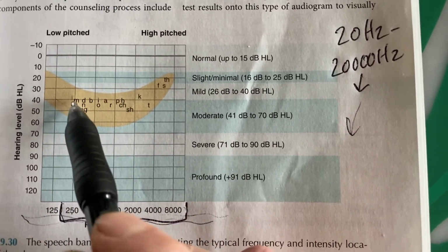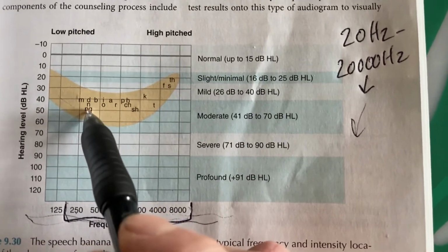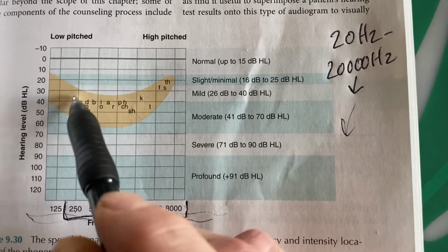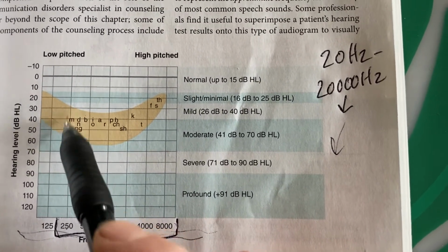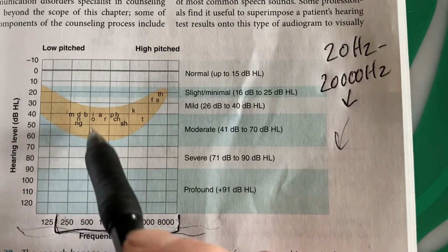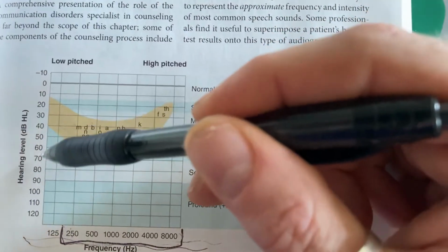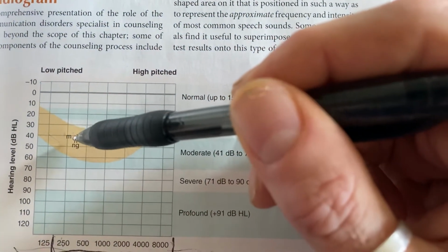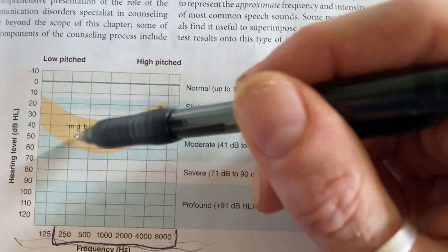In other words, d, b, n, and those 5 phonemes, the majority of their energy occurs somewhere between 250 and 500 hertz. And furthermore, along this axis, require the ability to hear sounds at around 40 to 50 decibels.